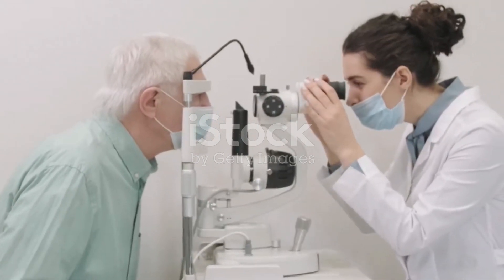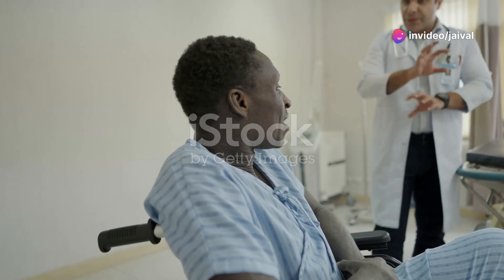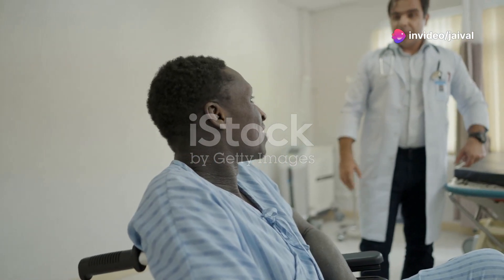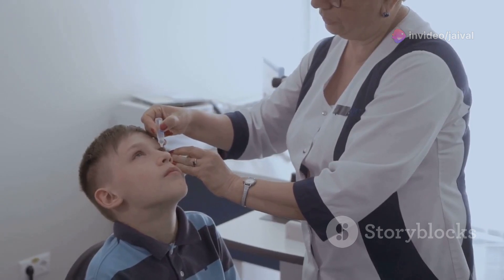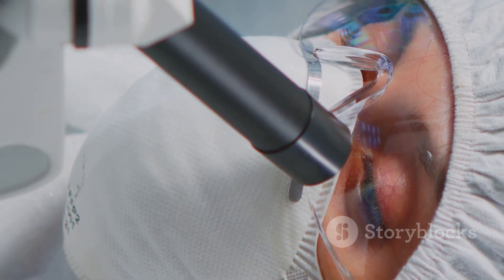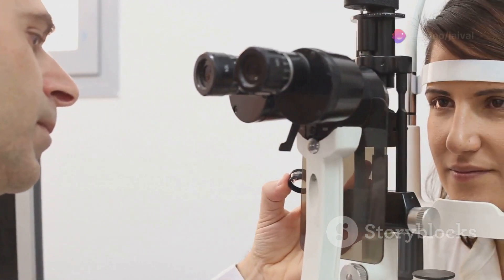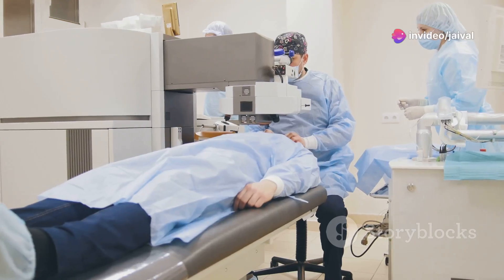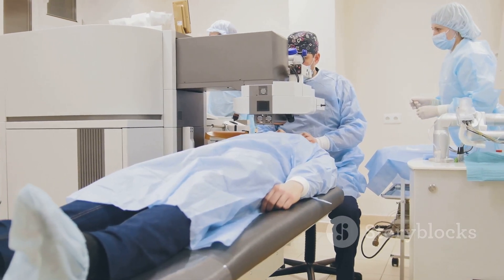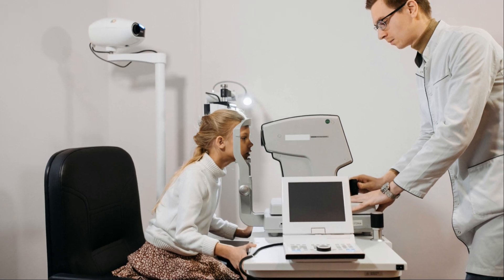Careful preparation ensures patient comfort and accurate gonioscopy. Explain the procedure to the patient and obtain informed consent. Instill a topical anesthetic drop to numb the eye. Apply a viscous methyl cellulose solution to the goniolens to eliminate air bubbles. Proper patient positioning at the slit lamp is essential. Adjust the slit lamp height and angle for optimal visualization. These steps ensure patient comfort and accurate findings, and proper preparation paves the way for a successful examination.